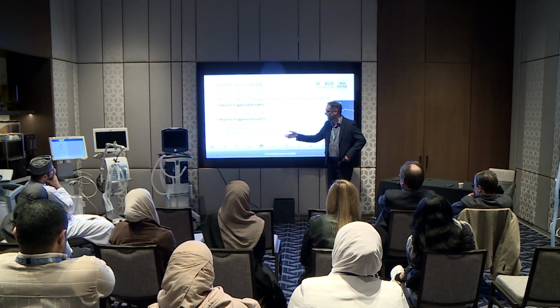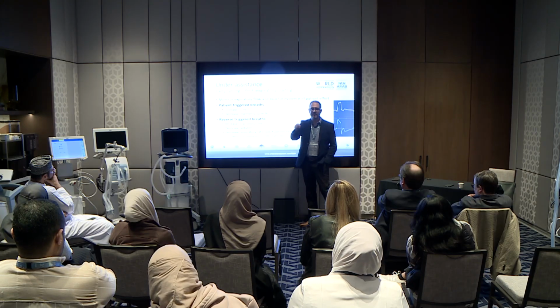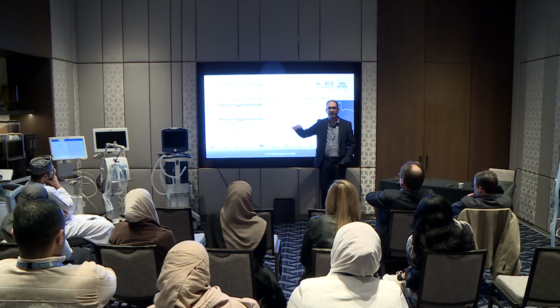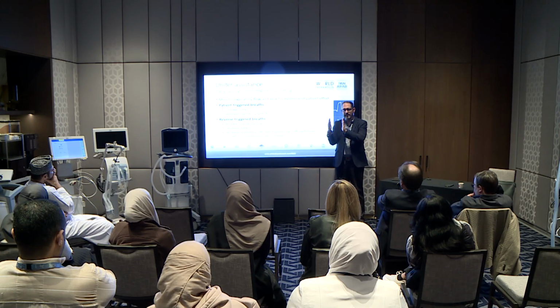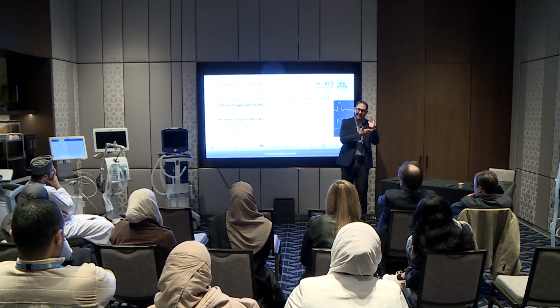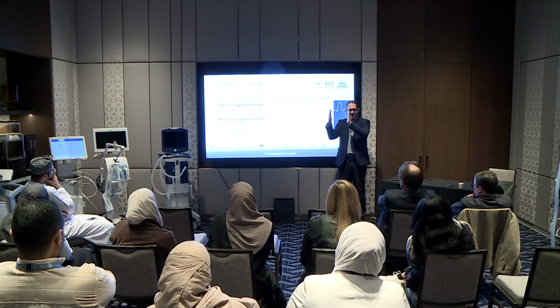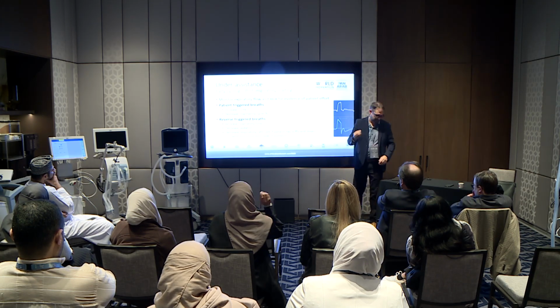If it's reverse triggering, you can try increasing the I time, decreasing sedation, or decreasing the respiratory rate and just see if they start breathing on their own. Because again, there might not be a problem with how long they're breathing, it's the fact that it's starting after the ventilator gives them the breath, that's why it's ongoing. But if you let them trigger the breath, it might not be early cycling anymore. You just have to let them trigger the breath. If they're ready for it, you'll find out.